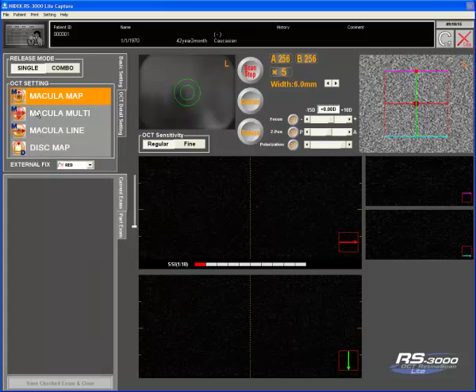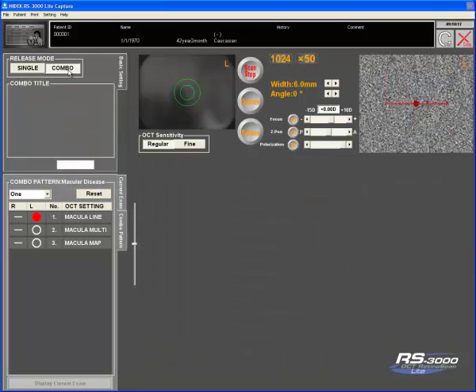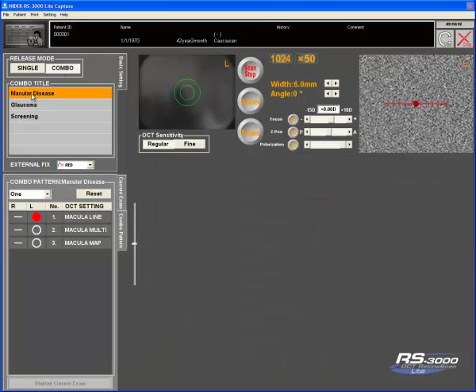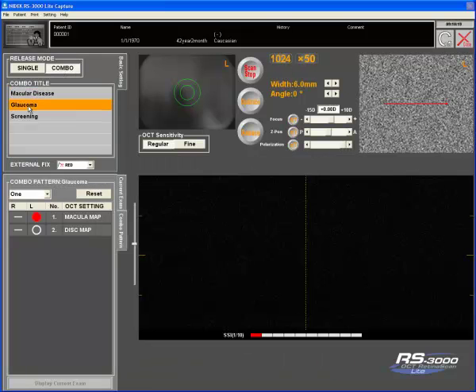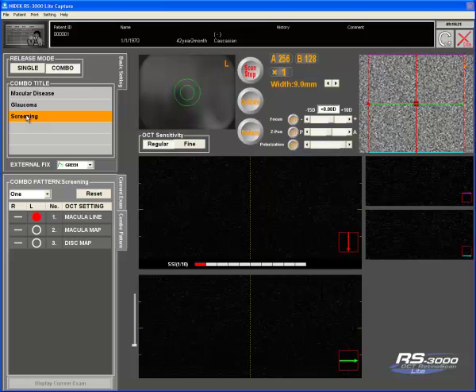To access those combination scans, I can hit combo and the different scans that I have chosen are here and available.